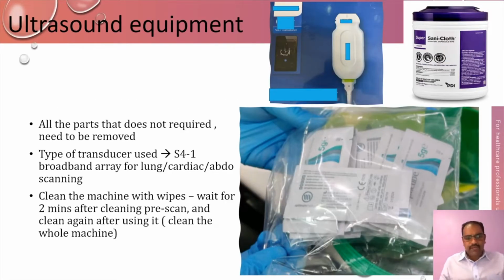So now let's talk about the basics of this ultrasound. If you see, currently in this COVID pandemic, I am more comfortable to use a portable ultrasound. What I'm using nowadays is a portable ultrasound, which is Lumify. It comes with a probe and a wire, which I can attach to a tab or phone.